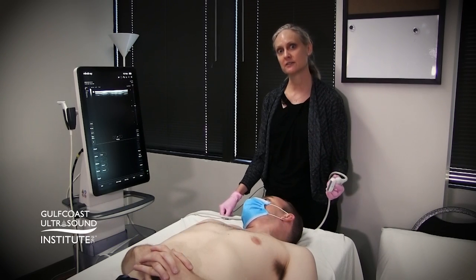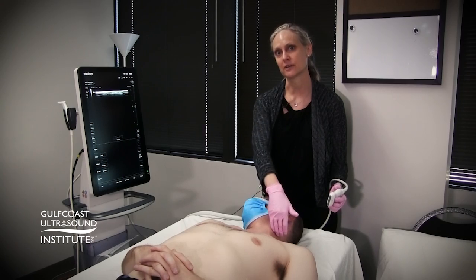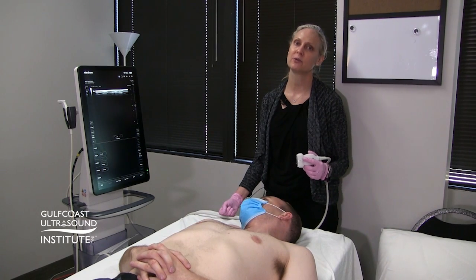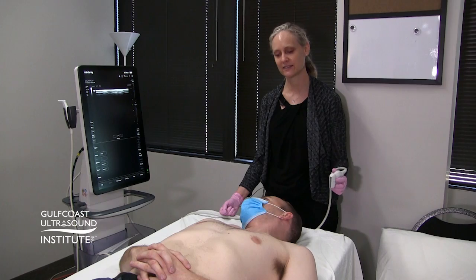Some providers are initially taught to find them at the level of the thyroid, moving from a medial to lateral direction. In the past, working with learners, I have found they've often had difficulty with this technique, so I'm going to show you a second technique for how to find the nerves of the brachial plexus at the level of the scalenes.